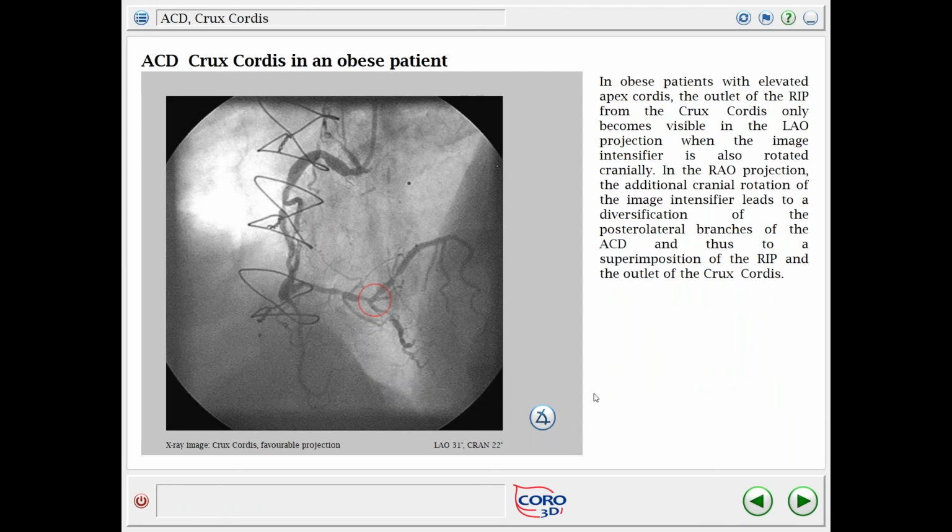Okay, Carlos, do you want to explain more about it? Yes, okay. So in the aim of reducing the use of radiology and X-ray, it's very important for the patient's health, and also for the environment. So many courses around endovascular cath lab training is about how could you get to the anatomical view of the heart or any organ you're targeting in less X-rays. So this is a good exercise that shows the planes, LAO and cranial positioning and degrees. Just by positioning the table and the C-arm, you could, with minimal X-ray, just get the view you want. So if you want to click on the exercise, go next.